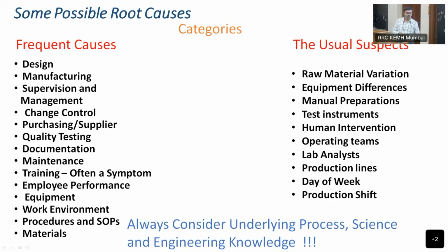Somebody does 1:5 dilution for, say, enzyme. We get incorrect result. When it will be compared with other lab, then we will have to face the dilemma of explaining why our results are differing from the other lab, which is usually a fact actually. So we have to face this every day if somebody has not followed the documented procedure.